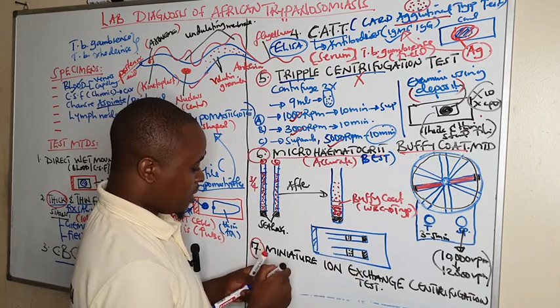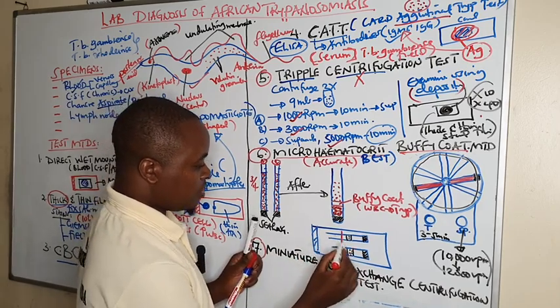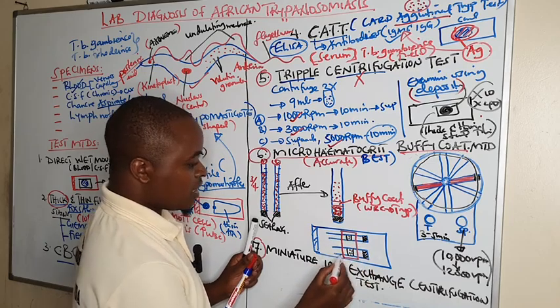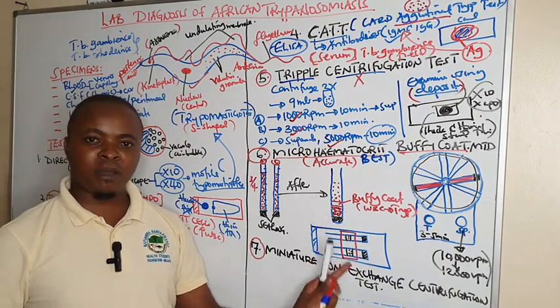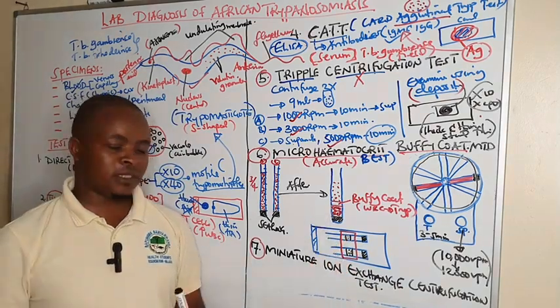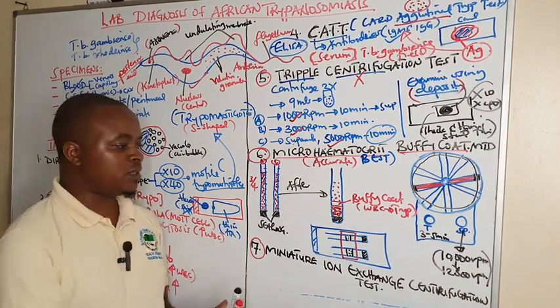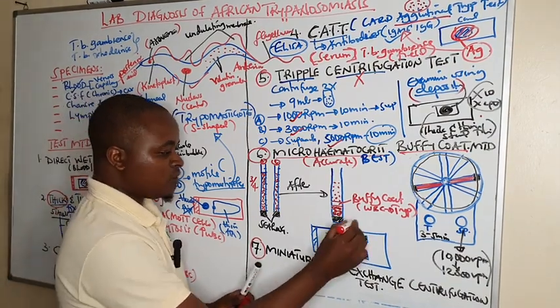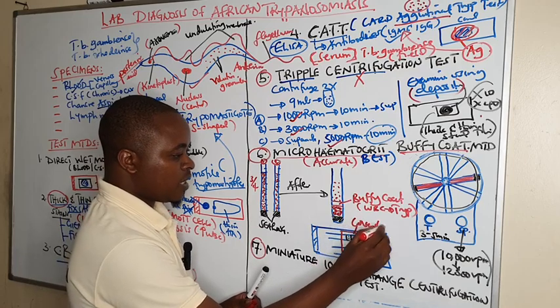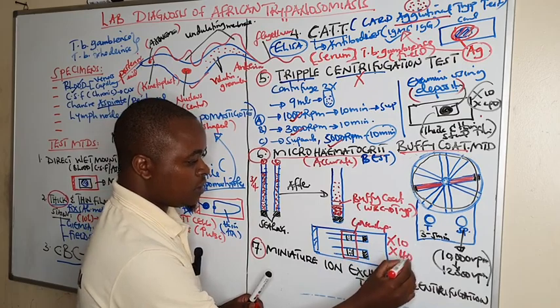So we come and apply a cover slip. On this slide is where there is a clear buffy coat. But before applying a cover slip, make sure the capillary tubes where the buffy coat is are well cleaned. After cleaning well outside and transparent, orient them on a slide, put a cover glass or a cover slip, and examine using times 10 and times 40.